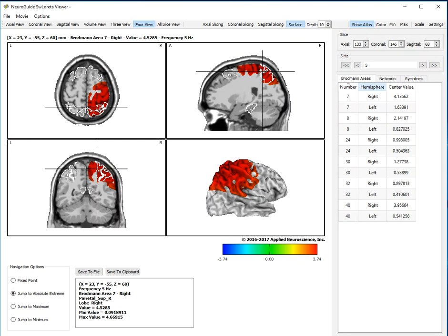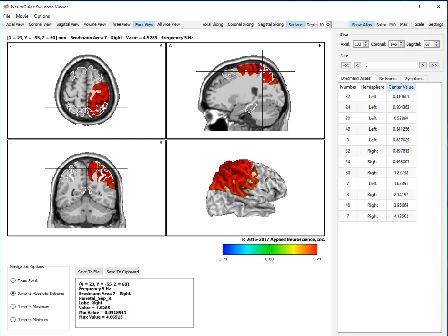We can sort by number, we can sort by hemisphere, we can sort by center voxel magnitude of the z-score.